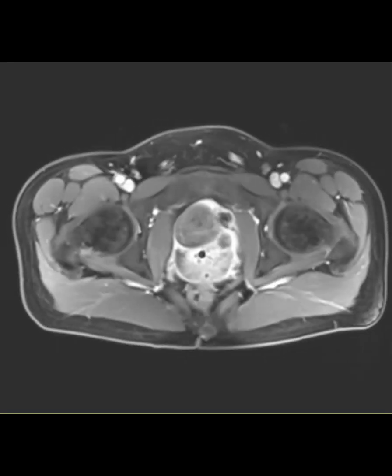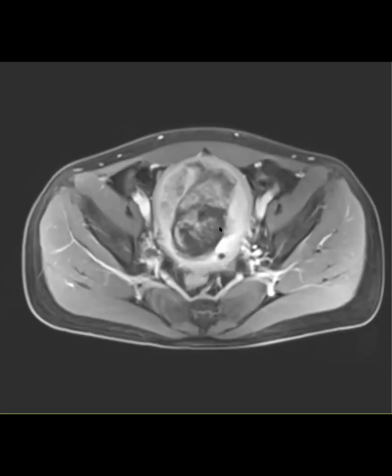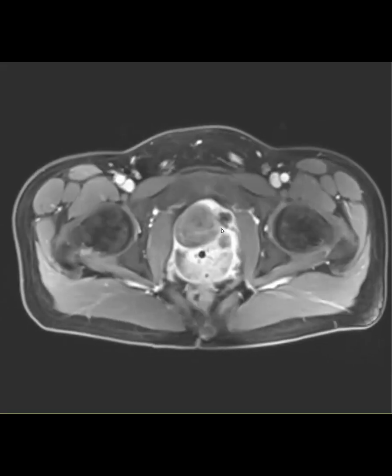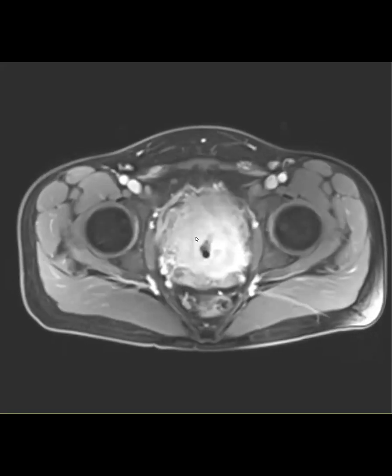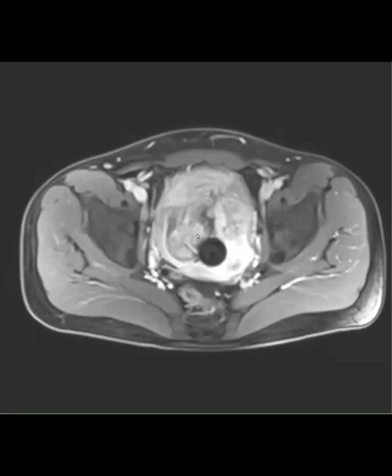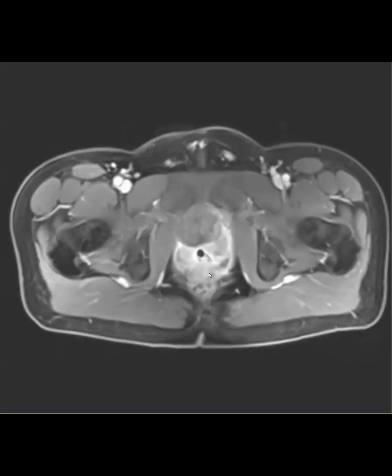Okay. Did this invade the prostate, or do you think it originated in the prostate? Yeah, it's hard to say where it originated. Most rhabdomyosarcomas of the GU tract, they say are of the base of the bladder and/or the prostate. So it's a little bit semantic. This one, I don't even know where the epicenter is. It's basically the base of the bladder/the prostate.